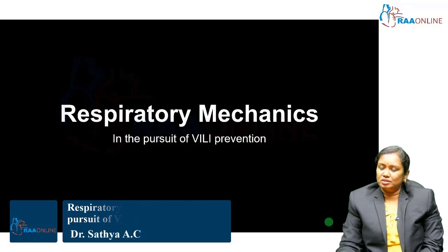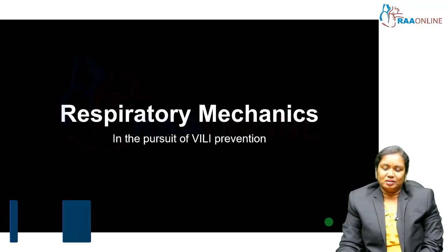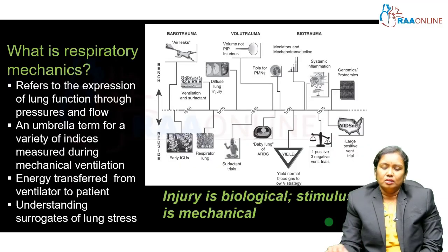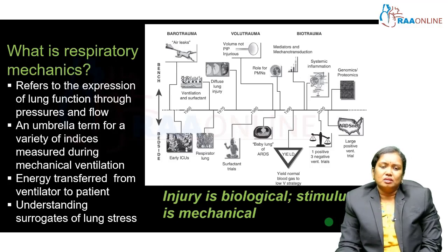Today's topic of discussion is respiratory mechanics. There are multiple ways to discuss respiratory mechanics for an intensivist. Our focus today will be respiratory mechanics in the pursuit of ventilator-induced lung injury prevention. How we are going to use respiratory mechanics to prevent ventilator-induced lung injury will be the major focus of our topic today. So what is respiratory mechanics?